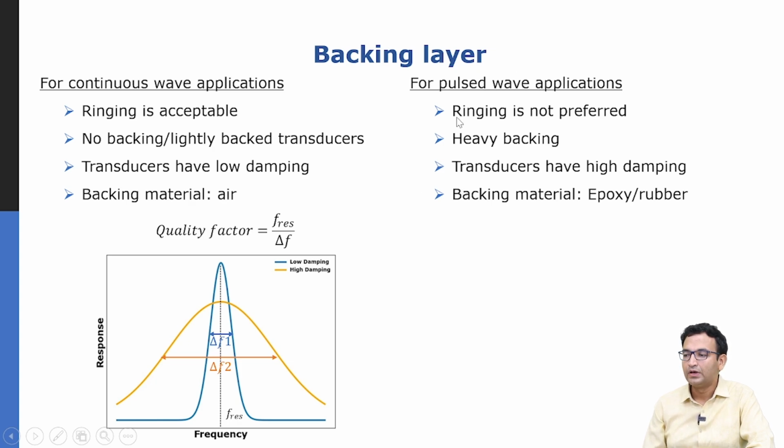So, like I said, for therapy applications ringing is adequate, but ringing is not preferred for imaging applications. You would like to have heavy backing that will damp this ringing, and materials such as epoxy rubber composites are used for backing in imaging transducers.